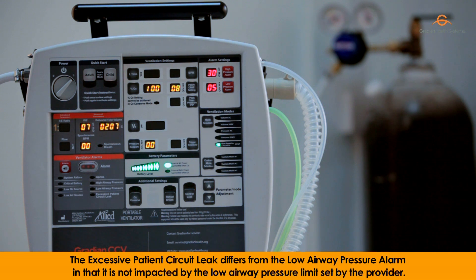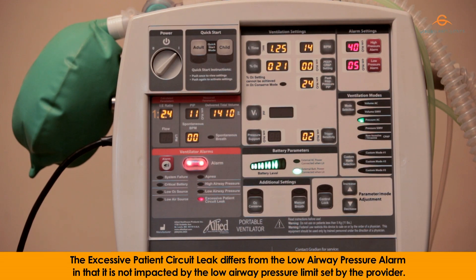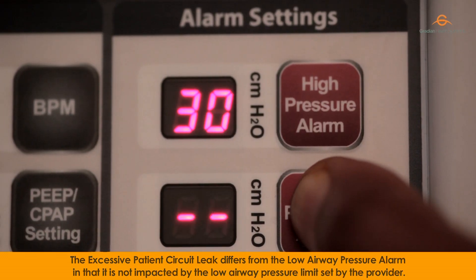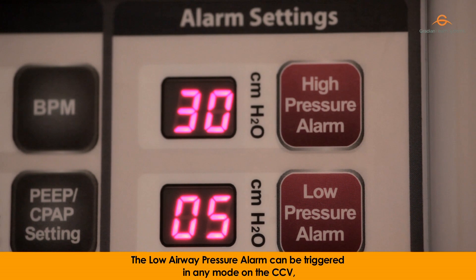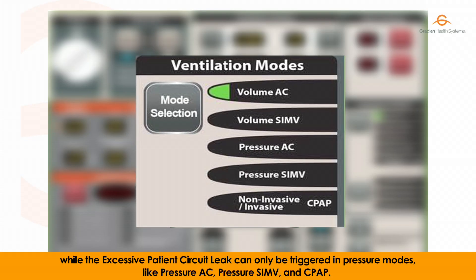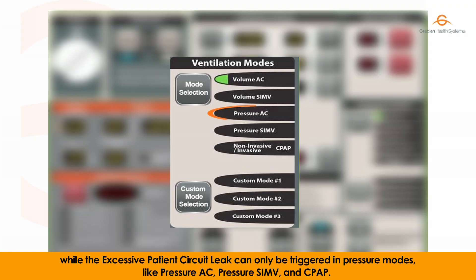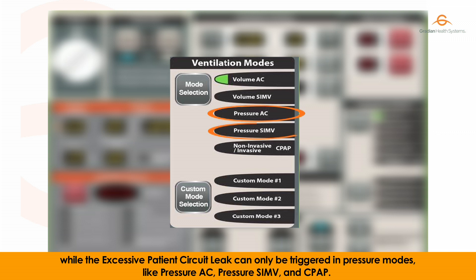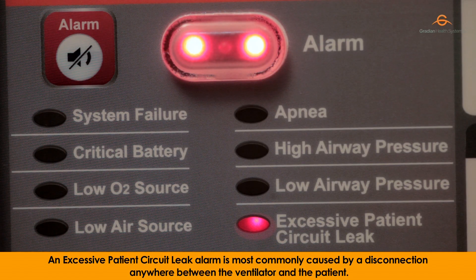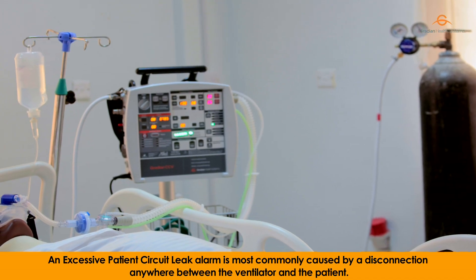The excessive patient circuit leak differs from the low airway pressure alarm in that it is not impacted by the low airway pressure limit set by the provider. The low airway pressure alarm can be triggered in any mode on the CCV, while the excessive patient circuit leak can only be triggered in pressure modes like pressure AC, pressure SIMV, and CPAP.